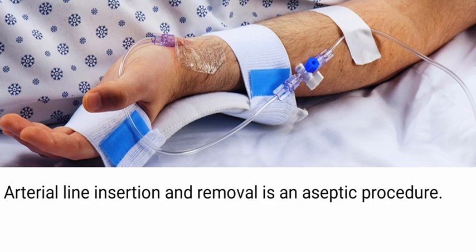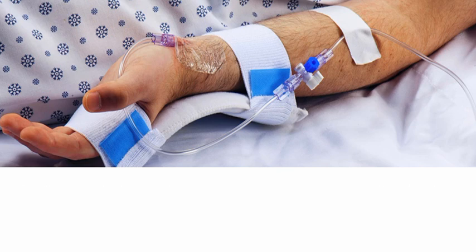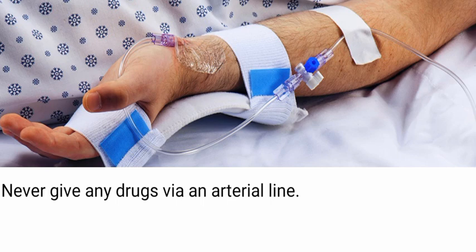Arterial line insertion and removal is an aseptic procedure. And lastly, never give any drugs via an arterial line.